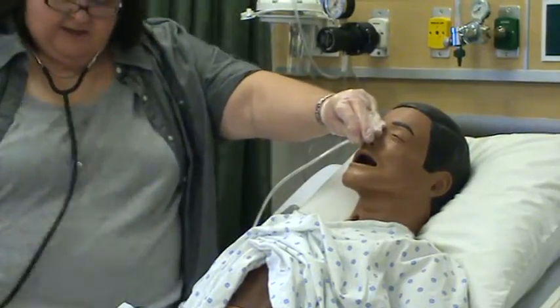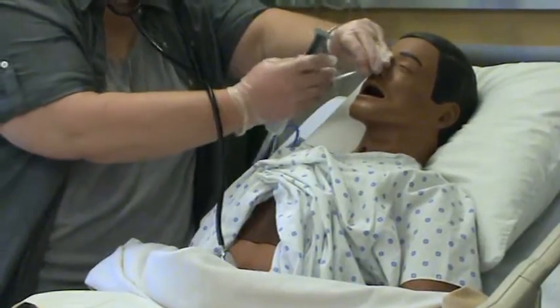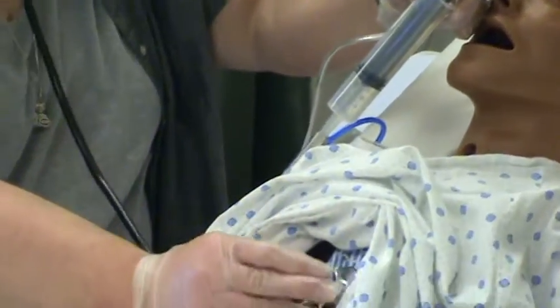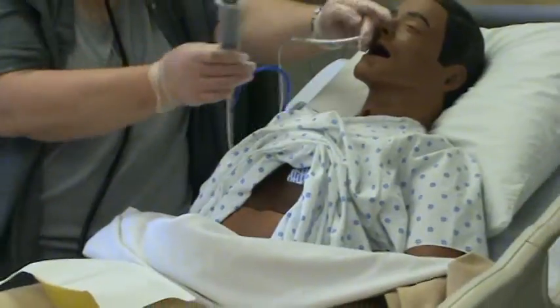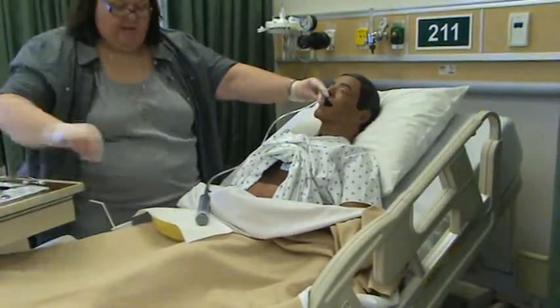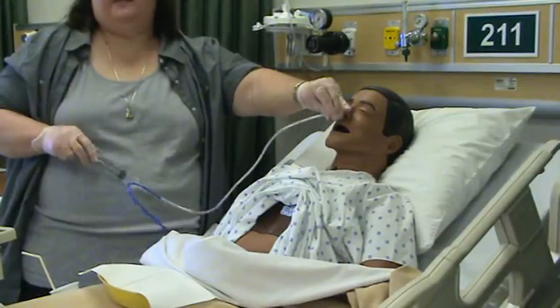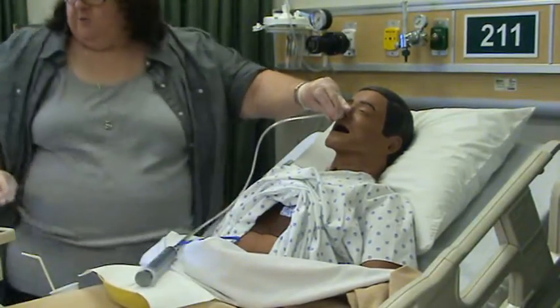I'll put the stethoscope in my ears and check to make sure I got this in the right place. I'll put it over the stomach. I heard the whoosh, so it is where it belongs. I'm also going to pull back real quick. Excellent — nice green GI contents. The tube's where we want it.